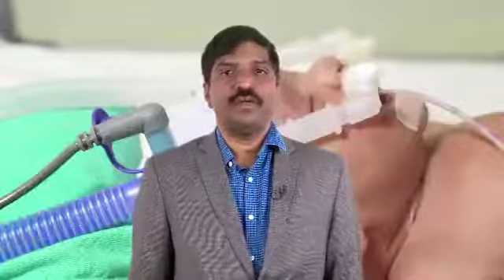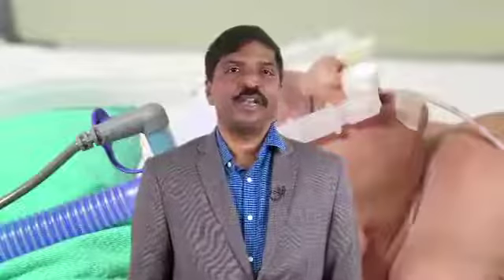Water logging in the inspiratory limb is avoided by a working heater wire, ensuring environmental temperature is between 28 to 30 degrees Celsius, preventing the placement of the temperature probe under the radiant warmer, and ensuring the placement of the last terminal segment of the inspiratory limb under the radiant warmer. The temperature probe should be covered with an insulating cloth or gauze if the probe falls under an incubator or in a radiant warmer.